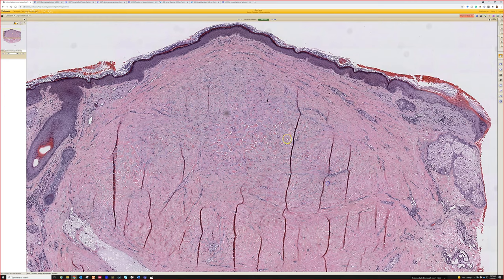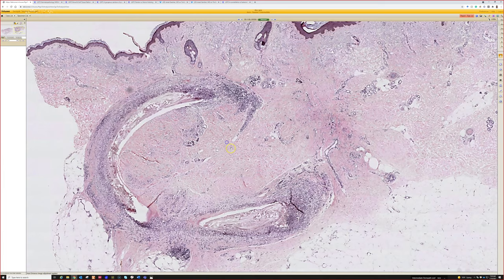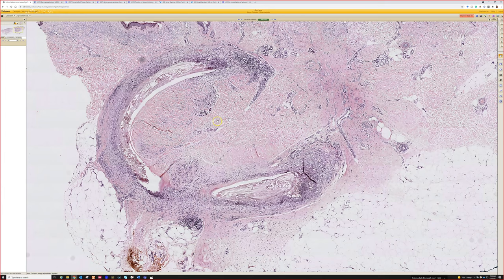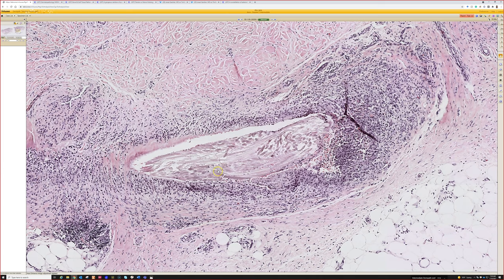Case two. It looks like we're in the deep dermis. There's something actually within the dermis, almost in a cavity, surrounded by what looks like inflammation. And it just doesn't look like anything the body would make — it looks foreign. That's an important skill to develop: to look at something and say this does not belong here. There's no normal human thing that looks like this. You may not even know what it is, but to say it's not from the body — that's very helpful.